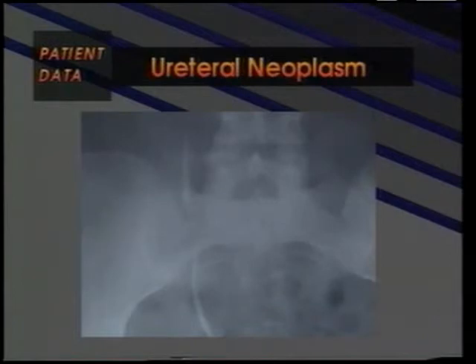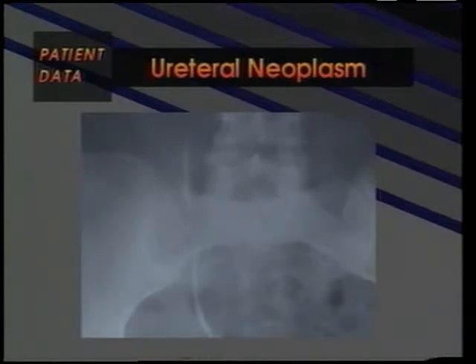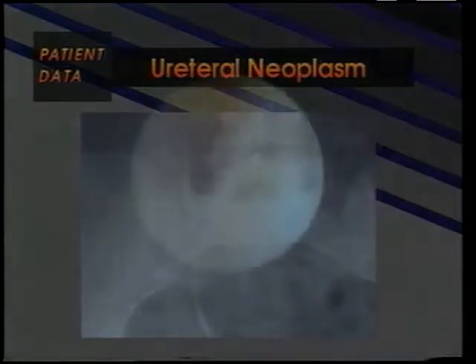This 52-year-old female had multiply recurrent low-grade transitional cell carcinoma of the bladder. She also previously had a right ureteral neoplasm treated endoscopically. In follow-up, she was found to have an irregularity in the same portion of the ureter on retrograde ureteropylography. Endoscopically, this had the appearance of a low-grade transitional cell carcinoma. Biopsy demonstrated a grade 1 transitional cell carcinoma.